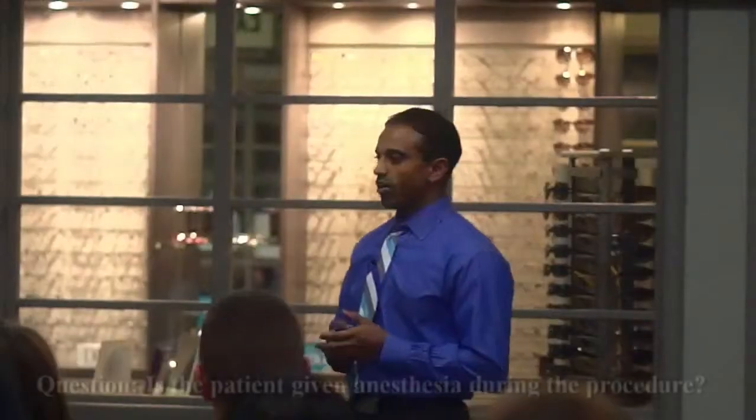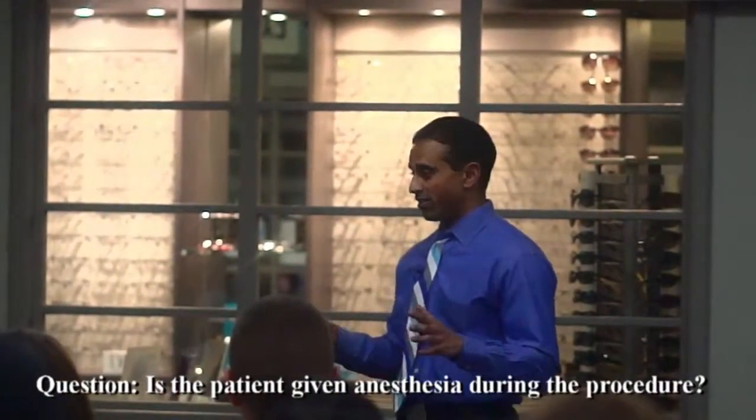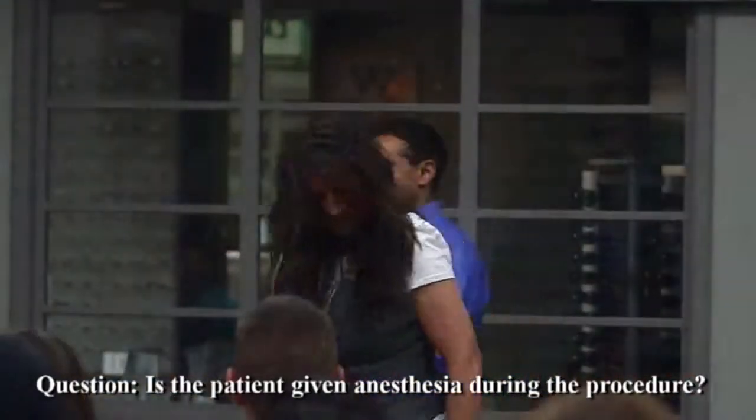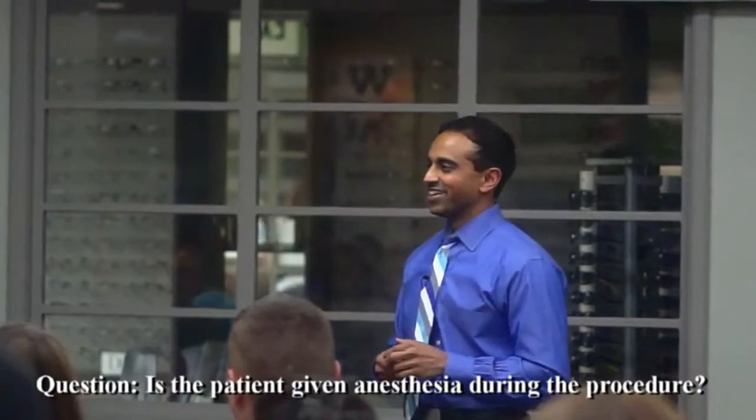So you get Valium, which is an oral relaxing medication. You're not going to be out of it because we want you to follow a little tracking. Yeah, that's understandable. Sometimes it's easier to go through not knowing a lot than knowing more.